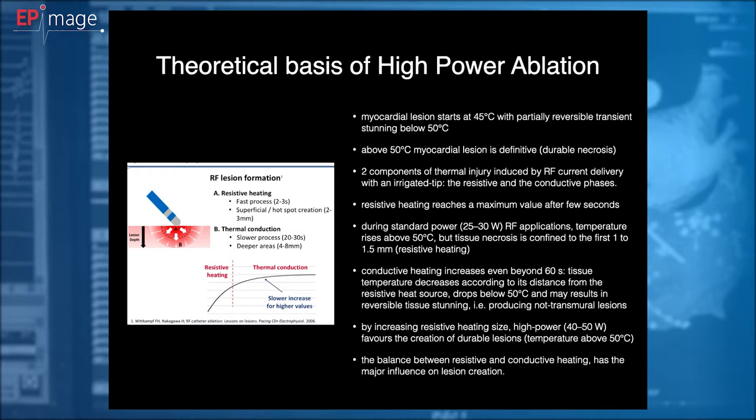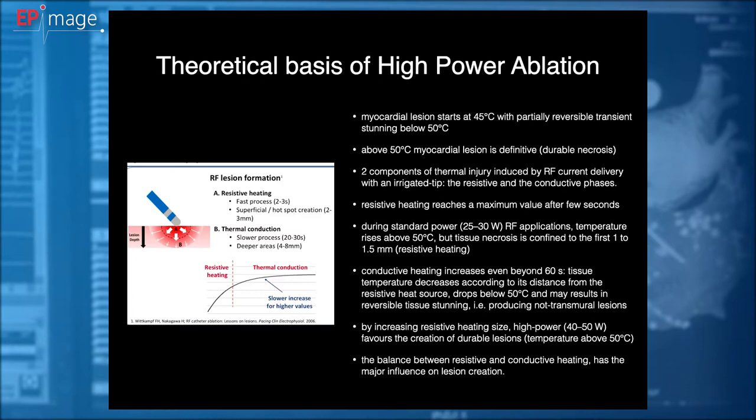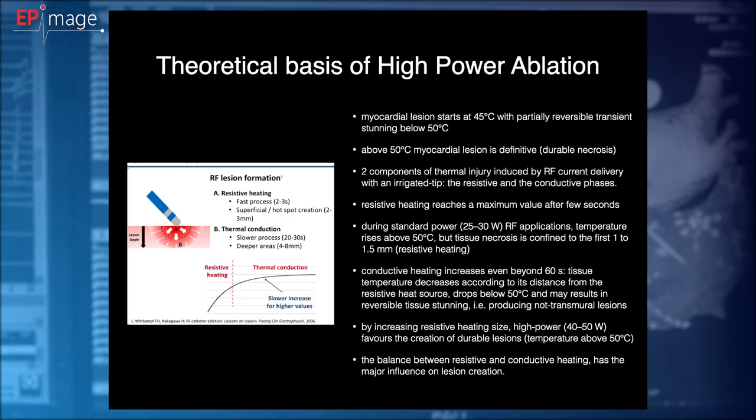But if we use high power ablation, we focus on resistive heating only, which favors the creation of durable lesions with temperatures above 50 degrees centigrade. So in fact, what we see with our ablation is just the balance between the resistive and conductive heating. And this balance has a major influence on our lesions. We want our lesion to be transmural and durable, and focusing on high power seems to lead us to the goal much faster.